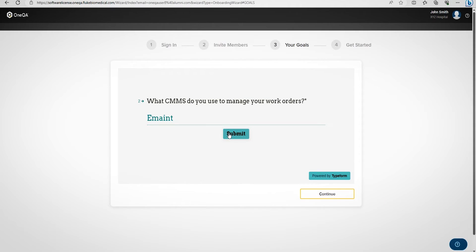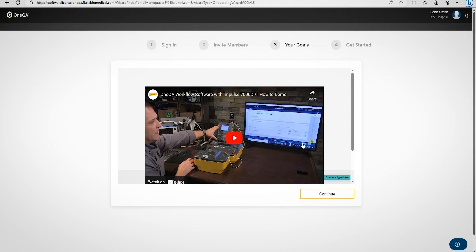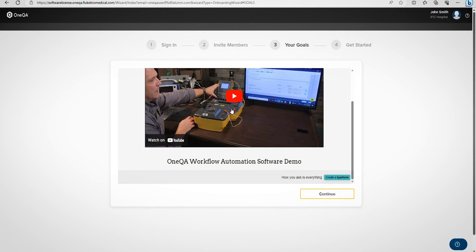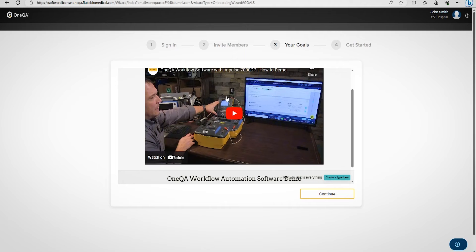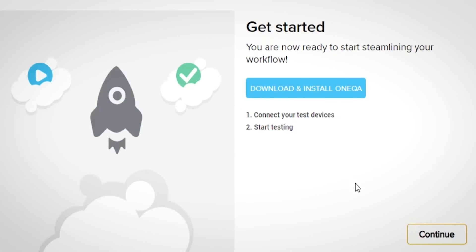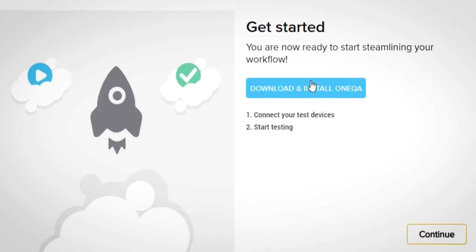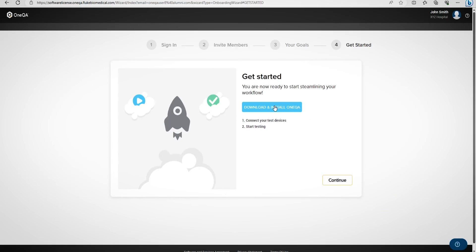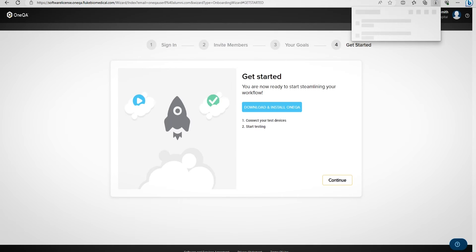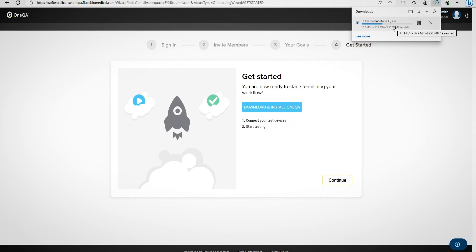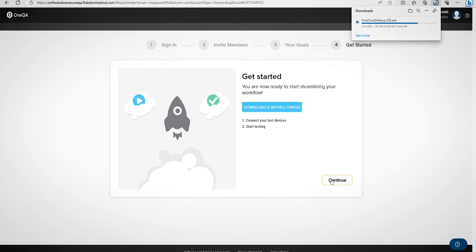Next, there's another video available if you'd like to watch it. The next step is to get started. To do this, you'll need to download and install OneQA. You may require admin privileges, and the system administrator can assist you with this. Download and install OneQA, and it will begin downloading the software for you. Navigate to your download folder and proceed to install the software.